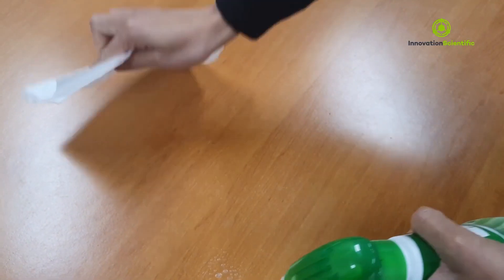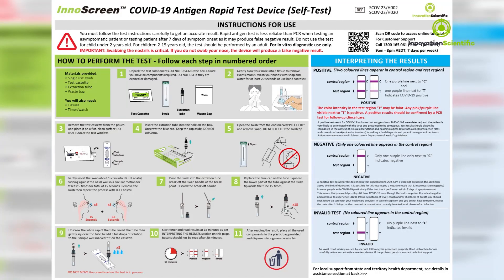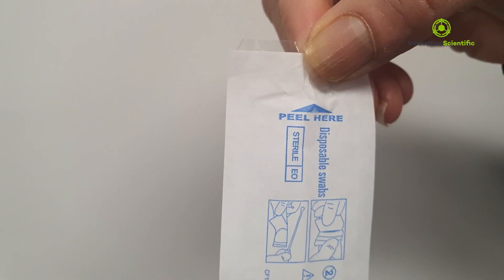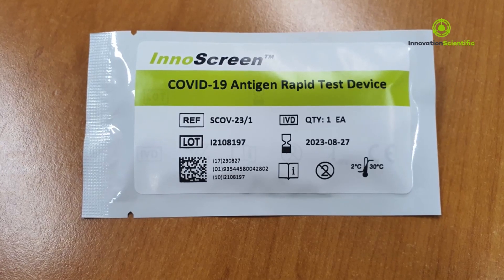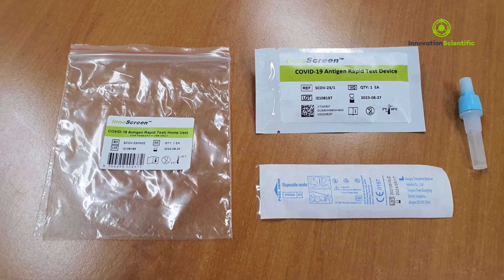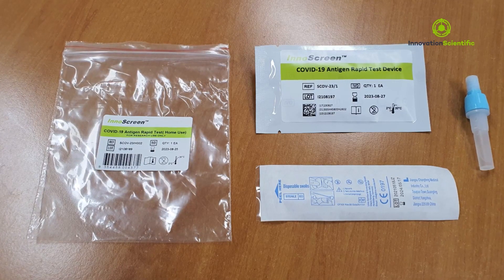Lay down the components on a clear and clean surface. To perform the test you will need: instructions for use, one single-use sterile swab for collecting the sample, one extraction tube, one individually packed test device, one waste bag. You will additionally need a timer and tissues.